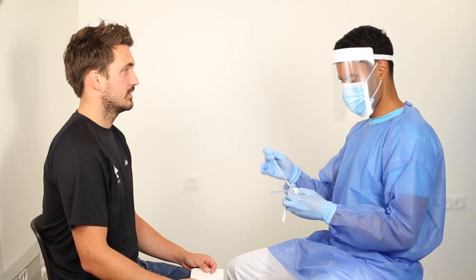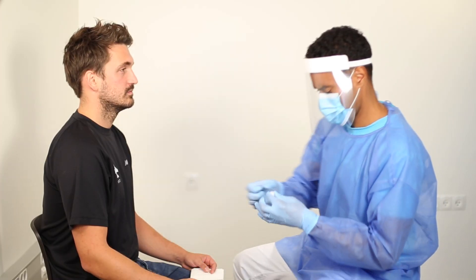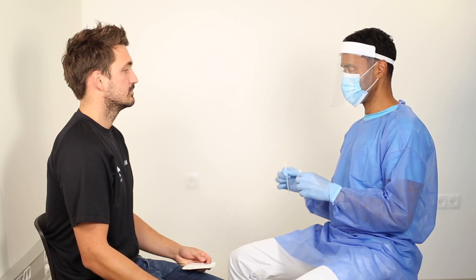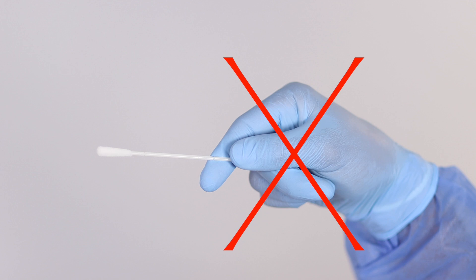Remove the swab from the packaging and open the lid of the viral transport medium. Ask the patient to remove the face mask during the procedure. When taking a throat or nasal swab, the shaft must be held correctly. It should be held between the thumb and the first and second fingers with the shaft protruding beyond the web of the thumb like a pencil, and not between the thumb and forefinger with the base in the palm of the hand. This will prevent the swab from causing injury if the patient makes a movement as a reaction to the swabbing.